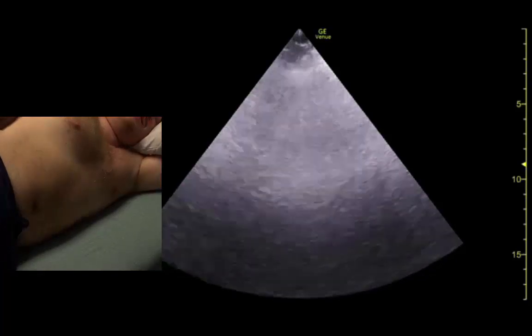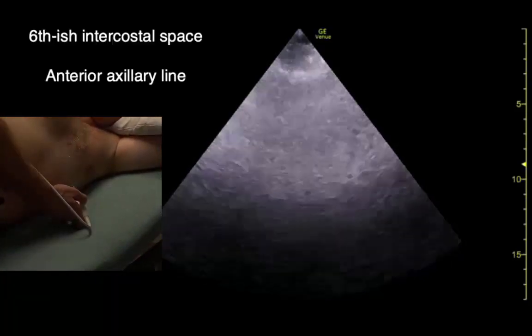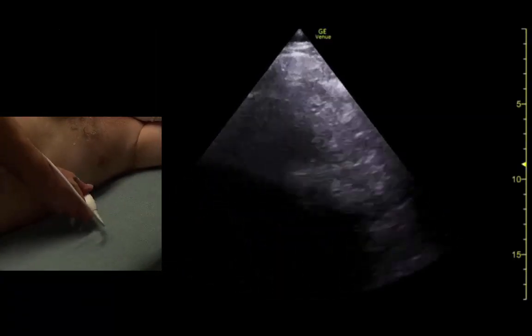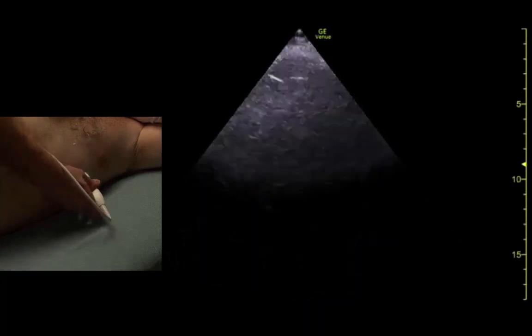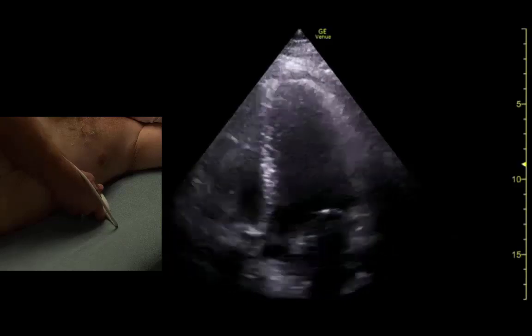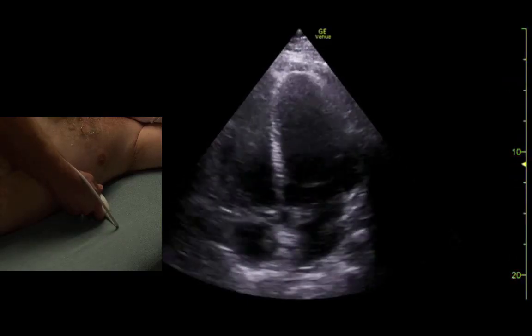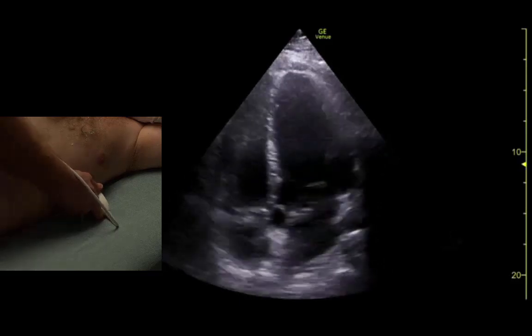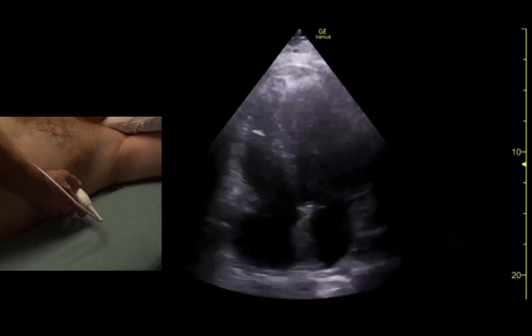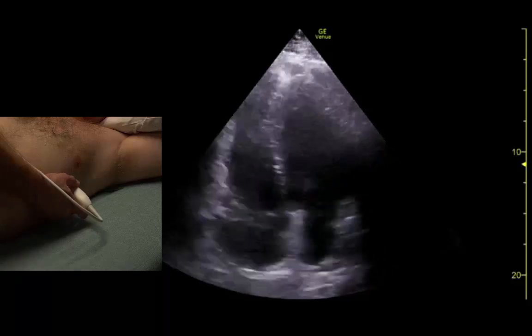For the apical four-chamber view, the indicator is out at about 2 to 3 o'clock. We come out to about the sixth intercostal space, and we wiggle our way up into the rib spaces until we see the heart. We try to make it vertical so we see all four chambers straight up and down.